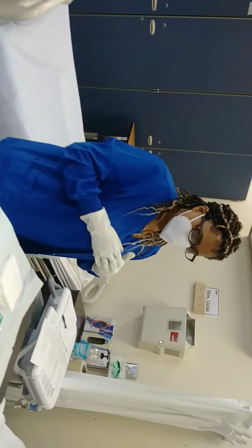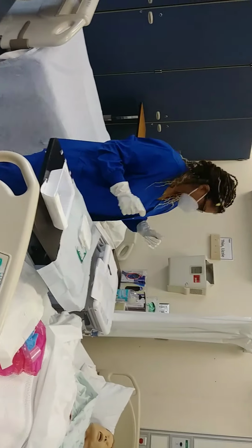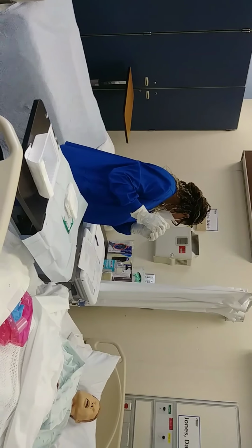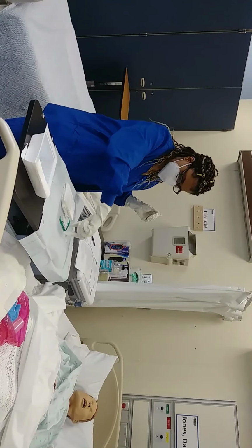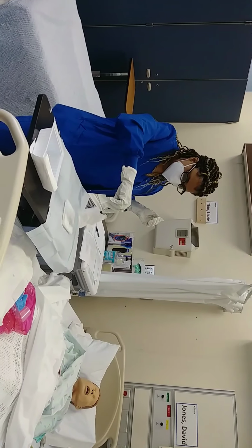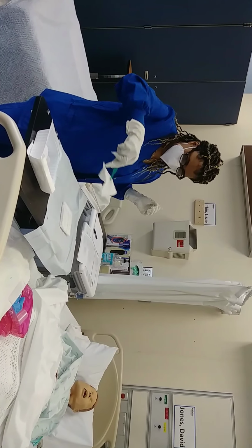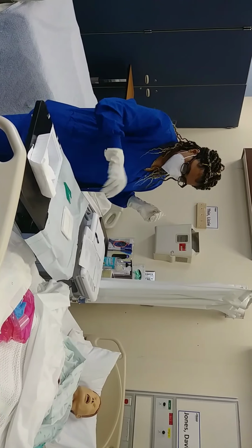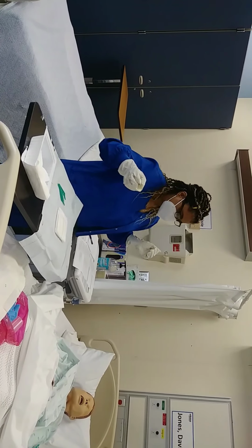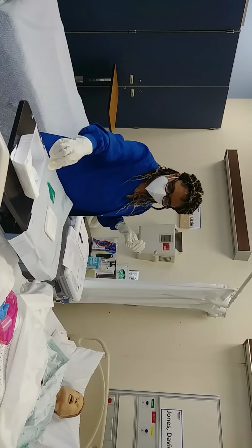Okay, so now that that's prepared, and I've already cleaned the wound, what I'm going to do is use the forceps, and I'm going to place the gauze inside of the water, just to prepare it. And then I'm going to now pack the wound.